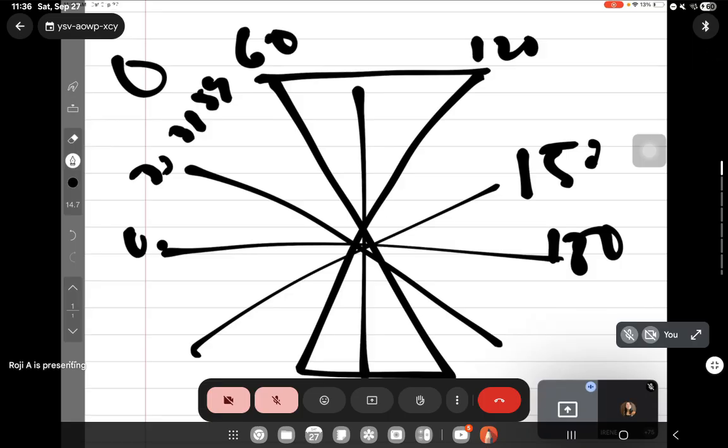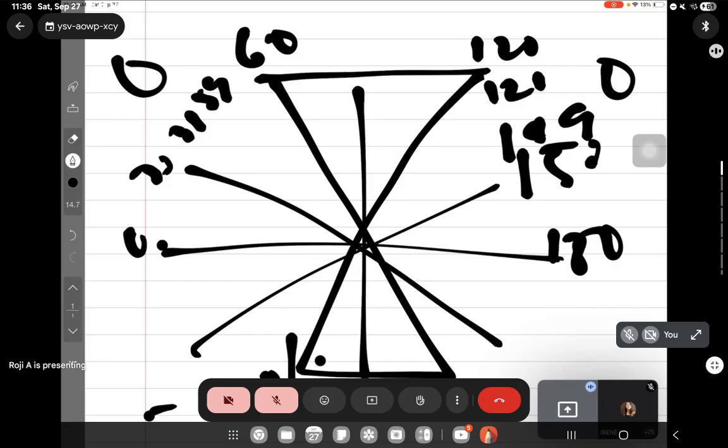Do you follow? Yes po. All right. My other oblique is now 121 to 149. If my Rx says minus 3 combined minus 2, axis 130, what does it mean?